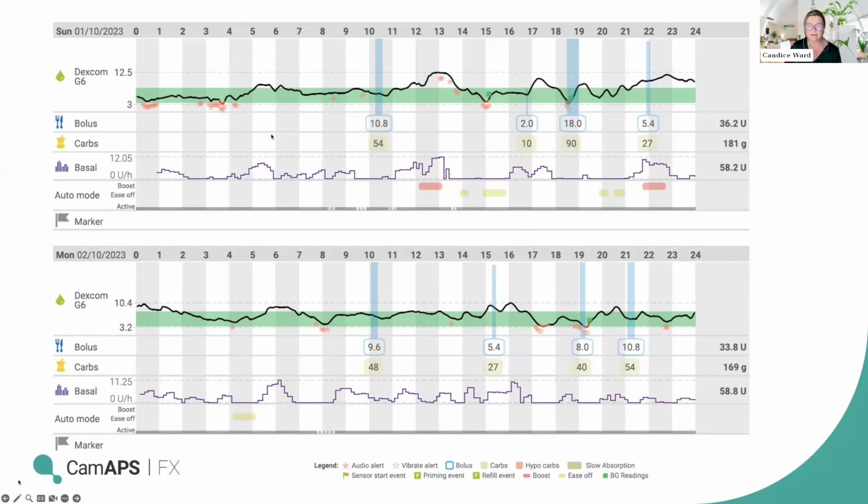So we need to really support her to address this worry, and maybe we might need to increase the personal glucose target a little bit higher and compromise, maybe 5.2, and see if she's willing to put the alarm down to 4.5 or something, just so that she's not woken up as much and triggered to hypo-treat.